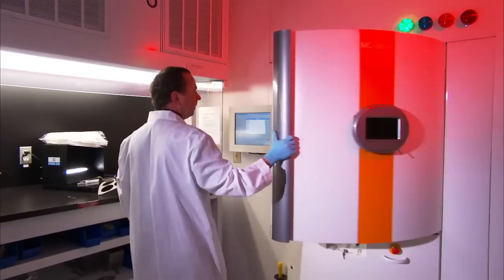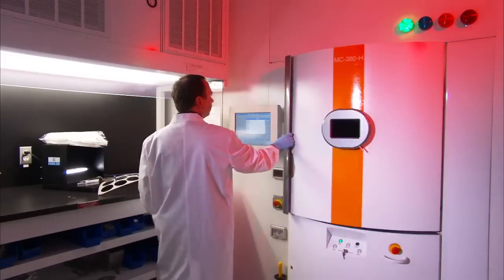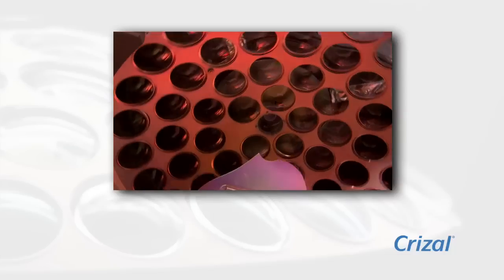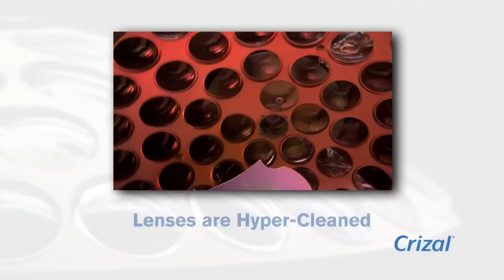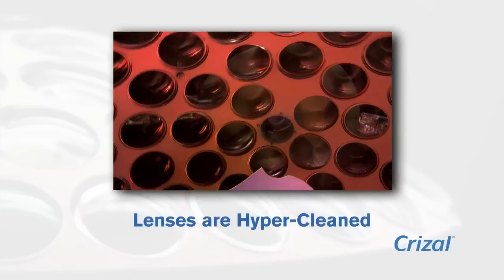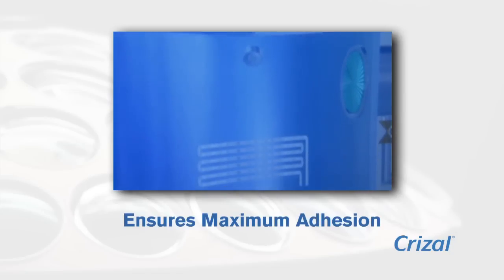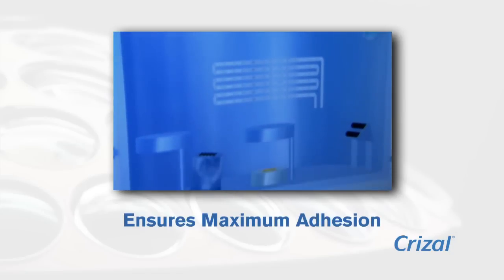Once in the chamber, lenses are bombarded with high-energy particles to hyper-clean the lens before anti-reflective layers are applied. This step ensures maximum adhesion of the AR layers.